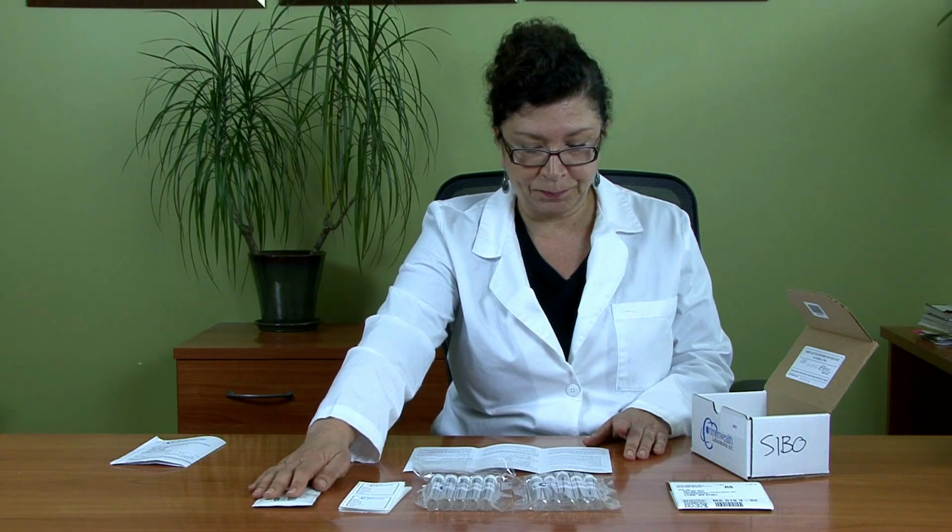Now, if you're a smoker, you cannot smoke on the day of the test. You cannot exercise on the day of the test, and of course, on the day of the test, since it's fasting, you cannot have anything except water and of course the Lactulose sugar that you're supposed to drink.